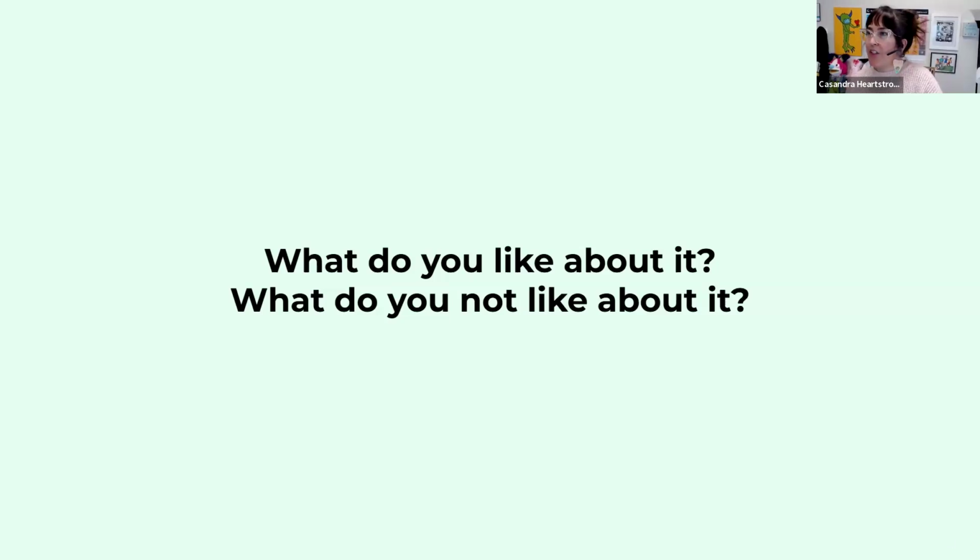I'm seeing in the chat you like the search feature, but you have to log in. Sometimes it can be difficult to find different words or program them, the core word setup and the way it's designed to grow.